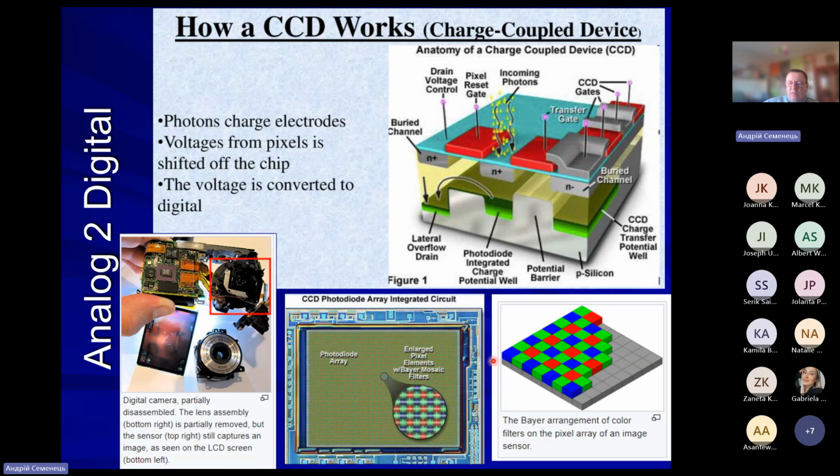They are all technically very similar, the difference only in details of the CCD device, which has to be tuned to a different wavelength. That is the only difference.